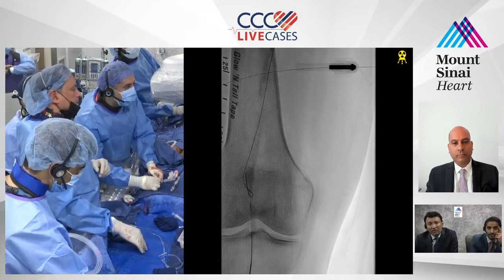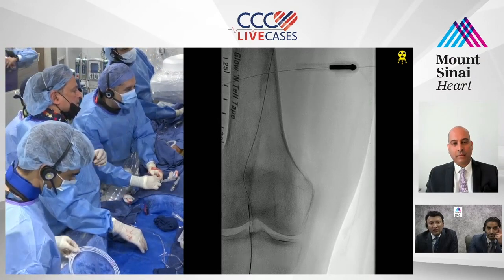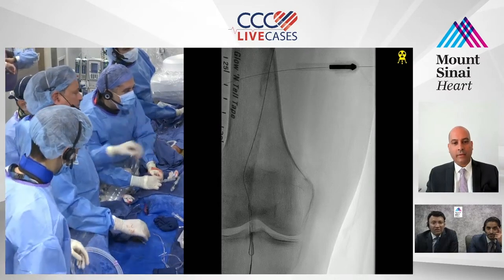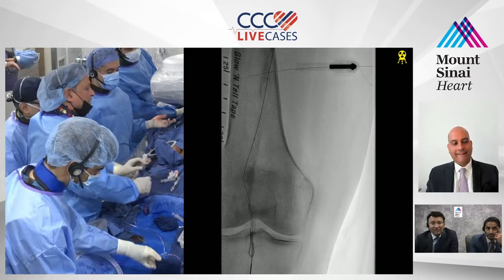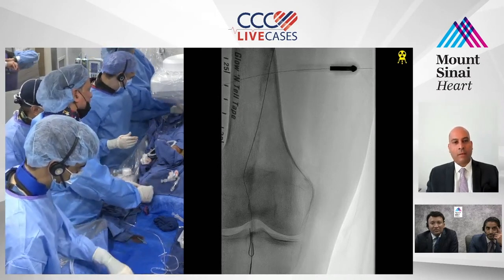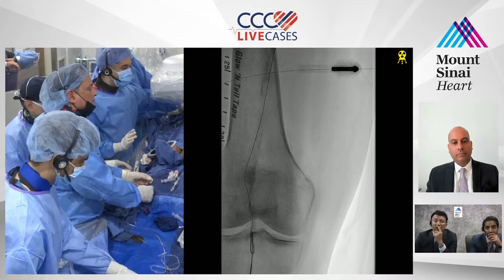No, I don't like that. It's a big loop, it's going to pop right in. Okay, you're in. It's in. Hold on. Can you track it down or no? It's going to be a little hard. Now you can lose the loop, Vishal. If you pull it back, you lose the loop. No, you have to get the catheter.